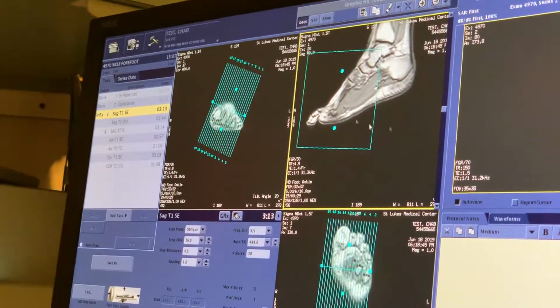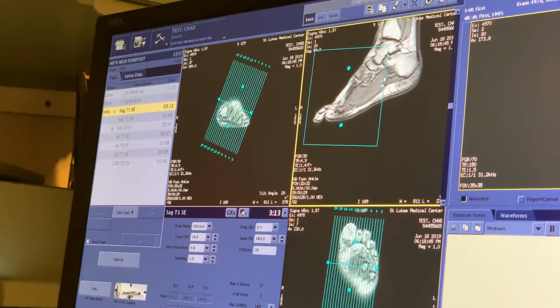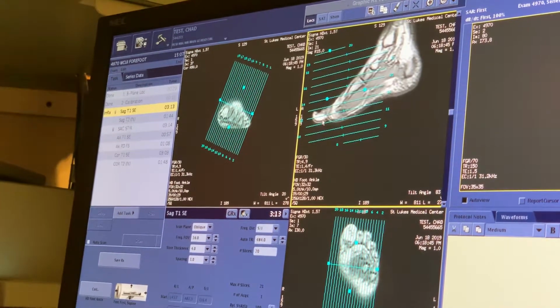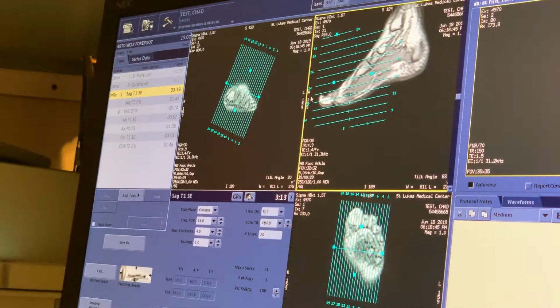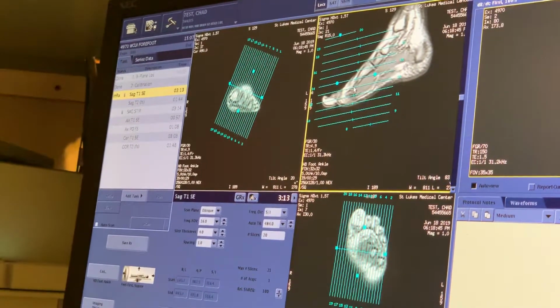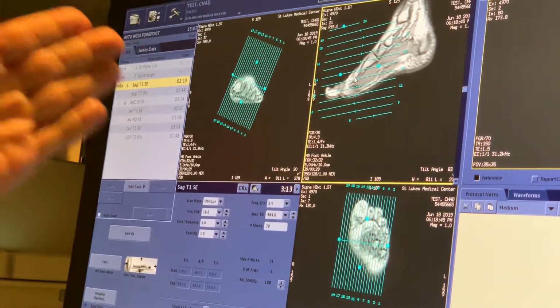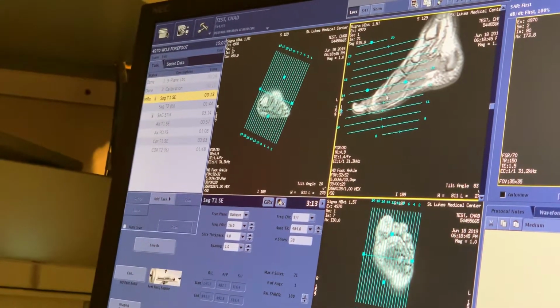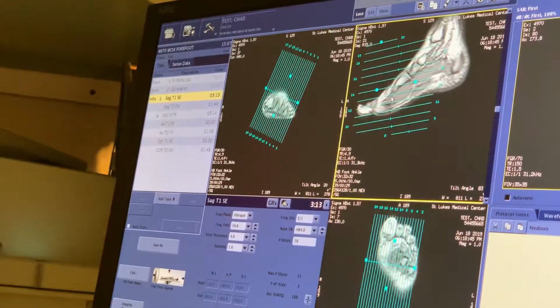So what I do is I just center up here so that, again, I want to include as much of the foot as I can, but I want to make absolutely certain that I don't clip that great toe. And just like I said with the sat band for the lumbar spine, how you have to be a little bit away from the vertebral body because it bleeds. Here, for some reason, if I park this right up against here and think, oh, I'm being oh so clever to get it exactly perfect, you're going to clip that toe.